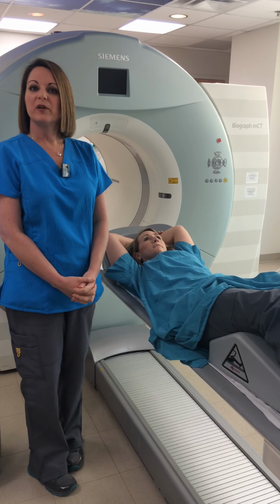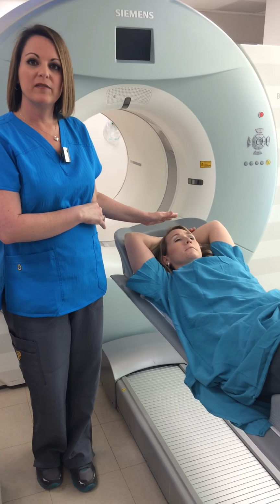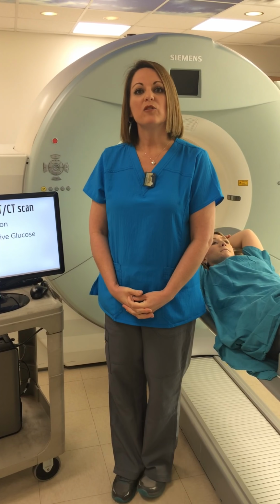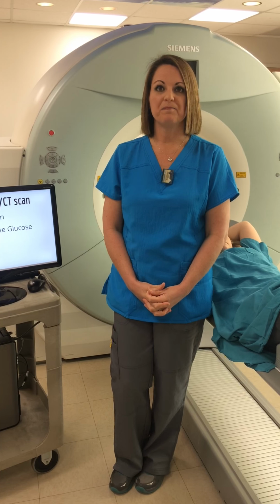The scan takes about 30 minutes. We'll be imaging from the eyes to the middle of the thighs. That takes about 20-25 minutes. Then we'll go back and do the brain, which takes about 5 minutes. Once the scan is complete, the patient is free to discharge with no extra precautions. The radiologist will interpret the reading and give the ordering physician the results. That usually takes about 2 days.